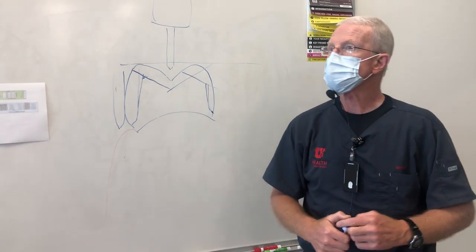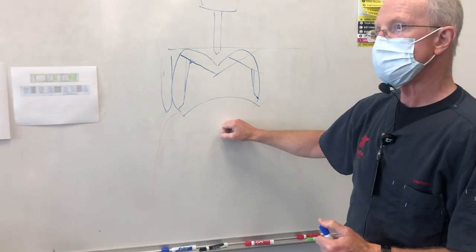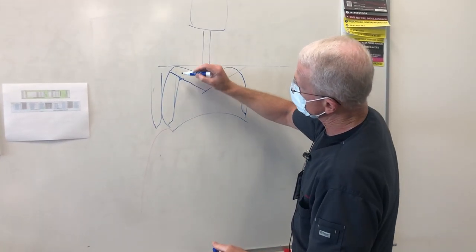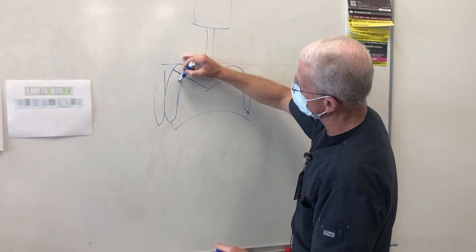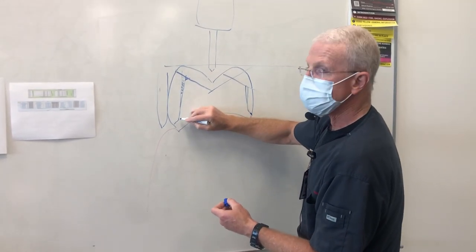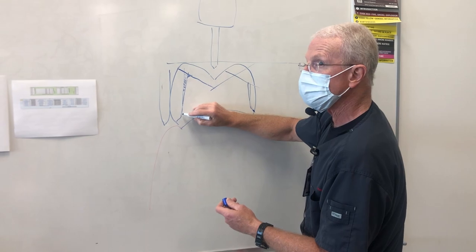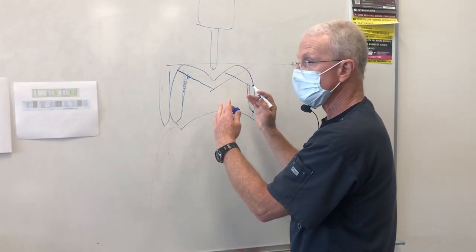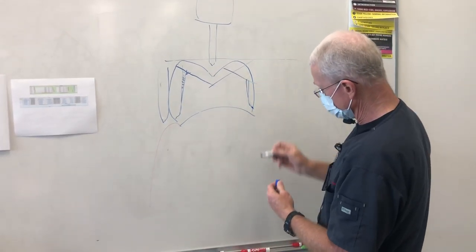Can you repeat why some of us don't have to do the two-plane? Yeah, so again, the two-plane, as you can see, I'm just taking off that little bit right there. And so if your axis happened to be a little bit more lingual, just by the way you lined it up, and this axial wall was over here.